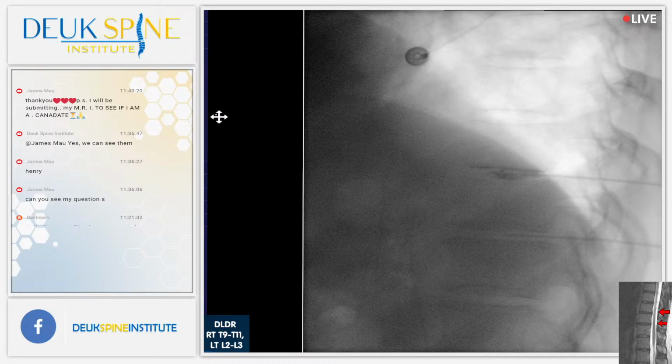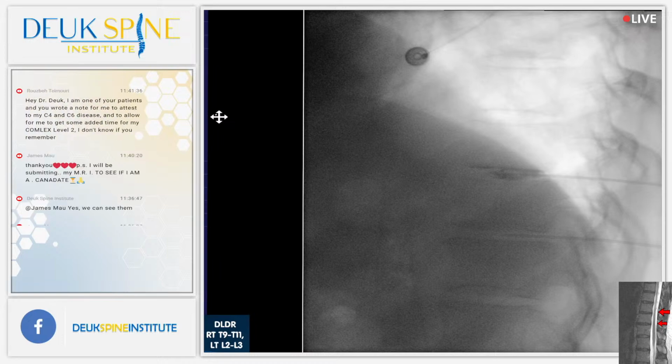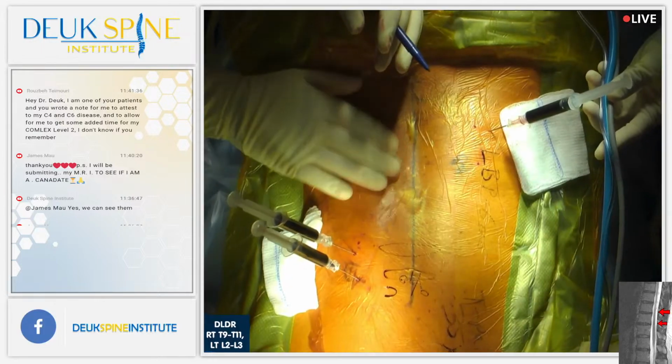Congratulations, we found one of your bad discs. We're going to fix it. That was your number 9-10. It was a 9 out of 10. It's concordant. That's the pain he typically gets. Is that better now?